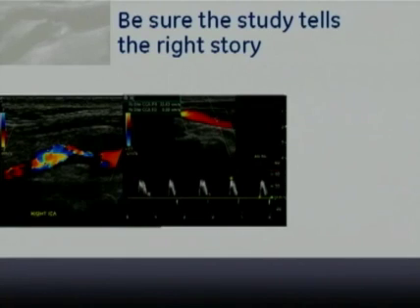Next, when she sampled in the common carotid artery, it looked like it was a very high resistance waveform and low velocity. It looks like the angle correction is good, but she's sampling in the middle of the vessel, but not in the middle of the flow. So I really feel like the sample location is not correct. It should be in the middle of the flow. And the image is so dark that I really can't appreciate whether or not there's plaque in this area, which there was.